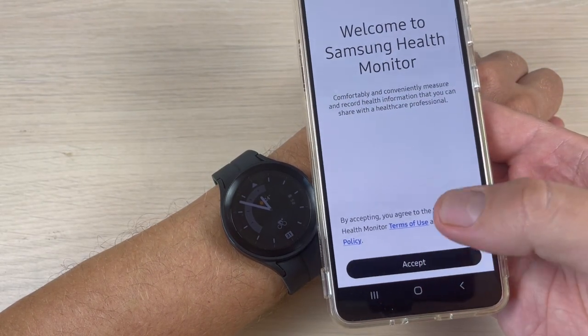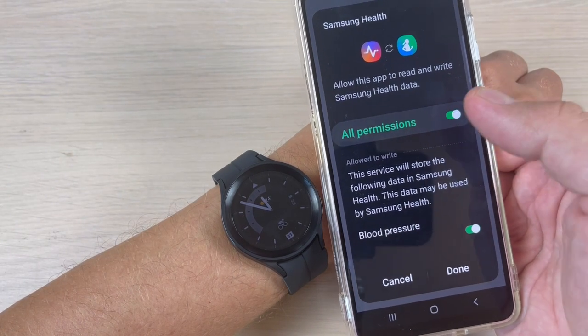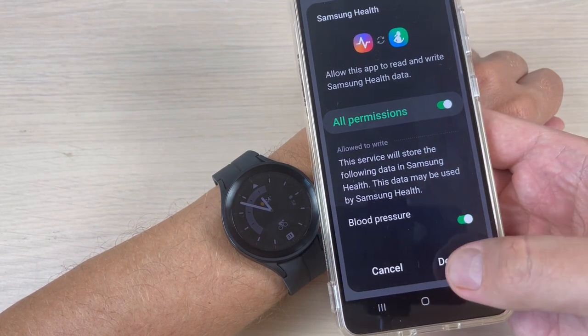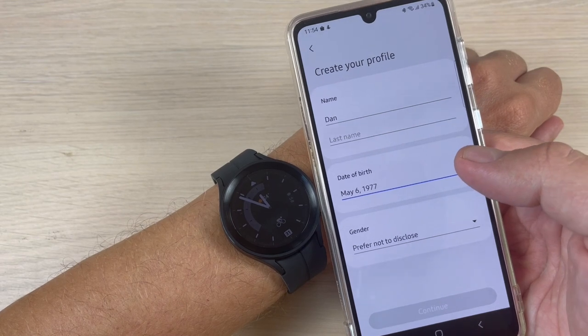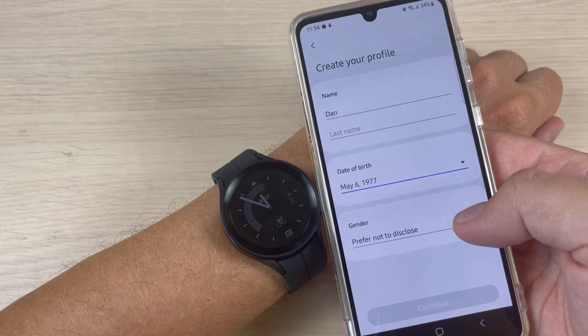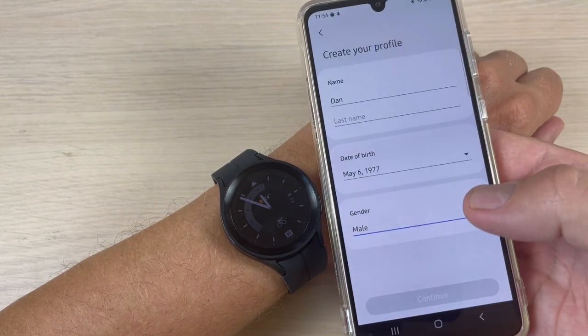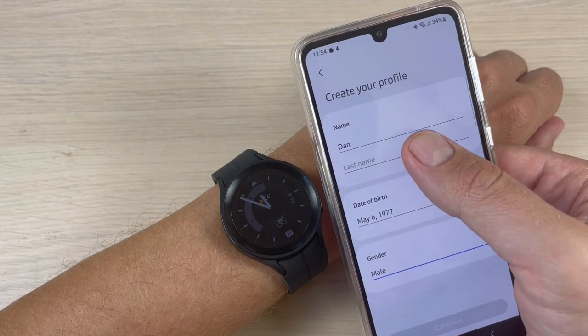Here press 'Accept', then enable 'Allow All Permissions' and just press 'Done'. Here you need to create your profile and select your gender. I will select 'Male', press 'Save', and enter your last name.